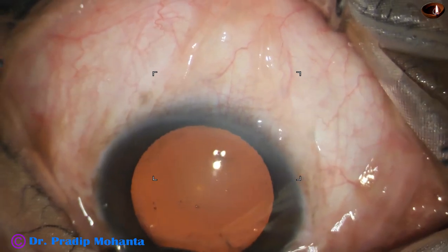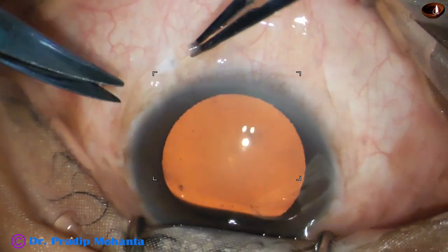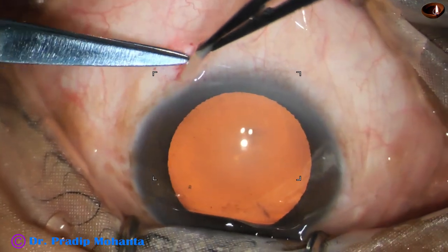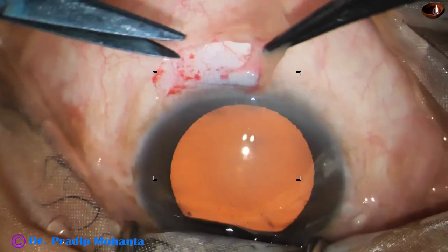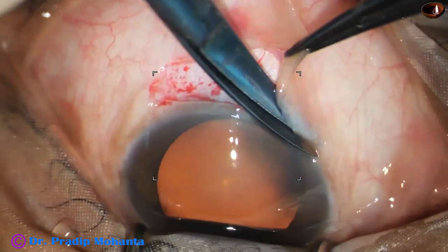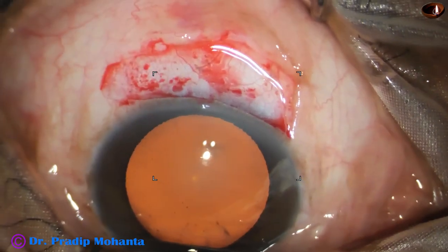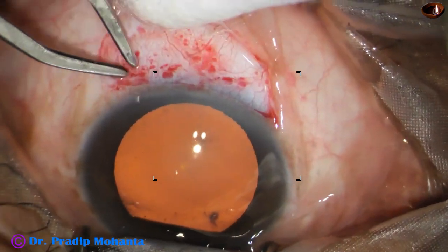Conjunctival peritomy is done for 2 clock hours with a small radial cut. The tenons is incised. The scleral surface must be exposed — if the sclera is covered with tenons, just cutting the conjunctiva will not help. The scleral surface is nicely exposed. This is conjunctival peritomy from about 11 o'clock to 1 o'clock.